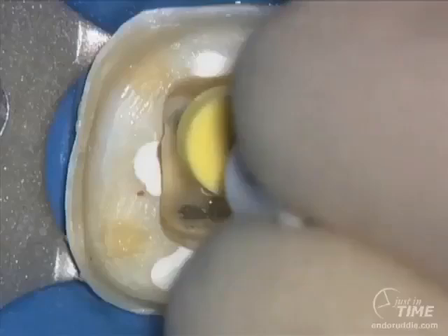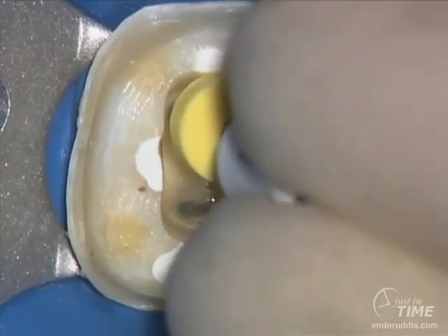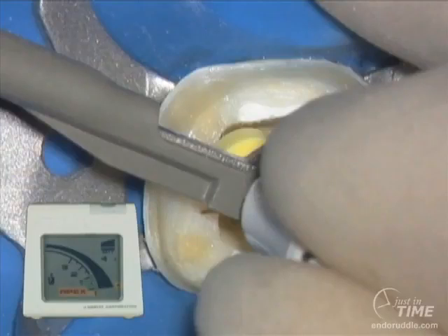Once I've worked a 10 and then a 15 file to the radiographic terminus, I need to confirm the vertical extent of treatment. This can be done either with films or it can be done using an electronic apex locator. Here you're looking at J. Morita's Root ZX, and this is the most popular apex locator in North America today. Notice the digital display is fully illuminated to apex.